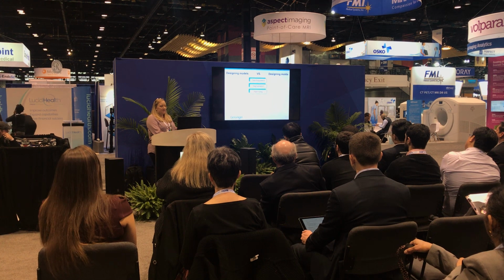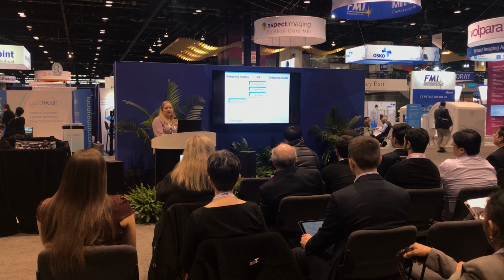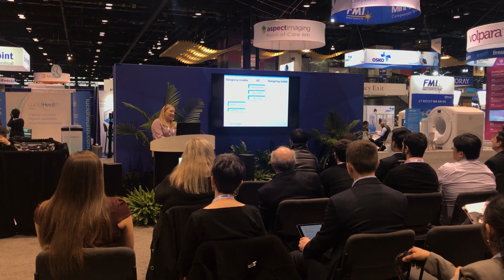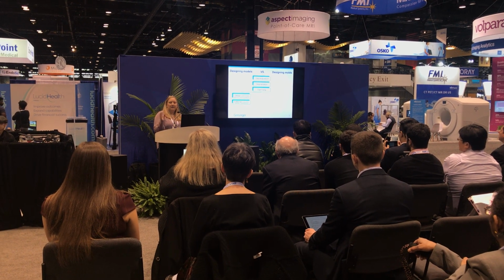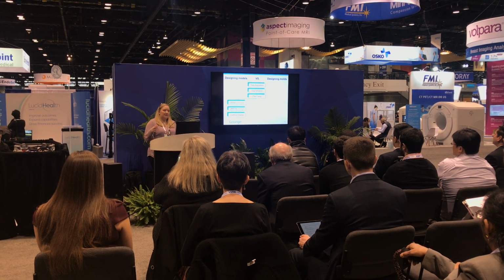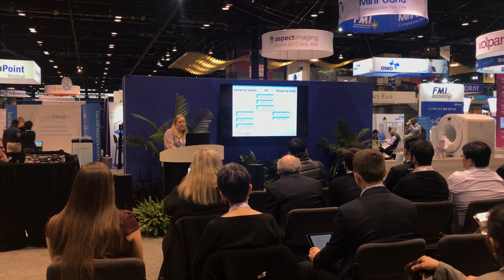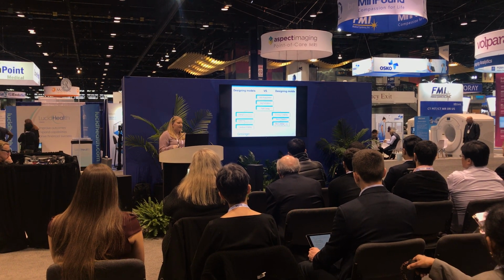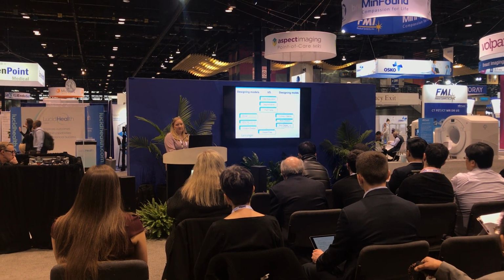So after you fix the parts, normally when you're designing a 3D printed model, you're gonna design from there. So you're gonna do your Boolean operations, hollow it if you need to, put positioning pegs. After that, you're gonna label, either with a unique patient identifier or any orientations you need, and then you're gonna check your contours. So when you design a mold, you're gonna go right into checking your contours, and then you can create that mold. After you create the mold, we're gonna design the mold so you can split it up how you need it, add fill holes, exhaust holes, labels, all that good stuff. And then it comes back together and you export those files for printing.